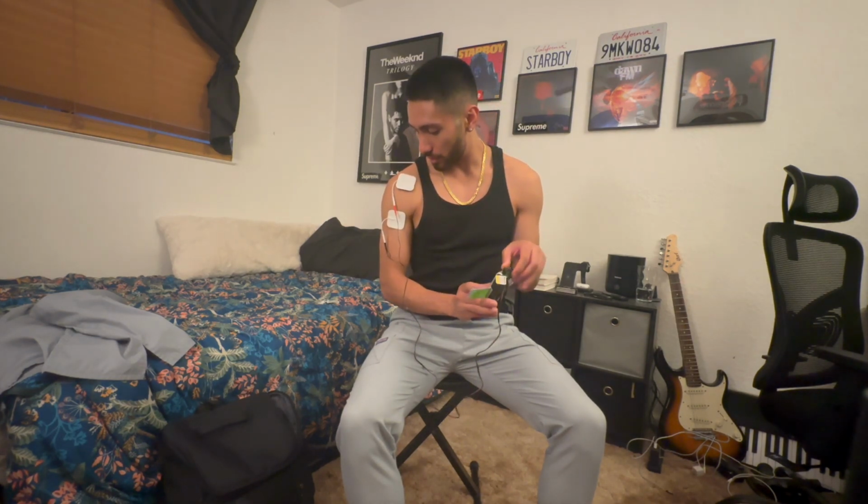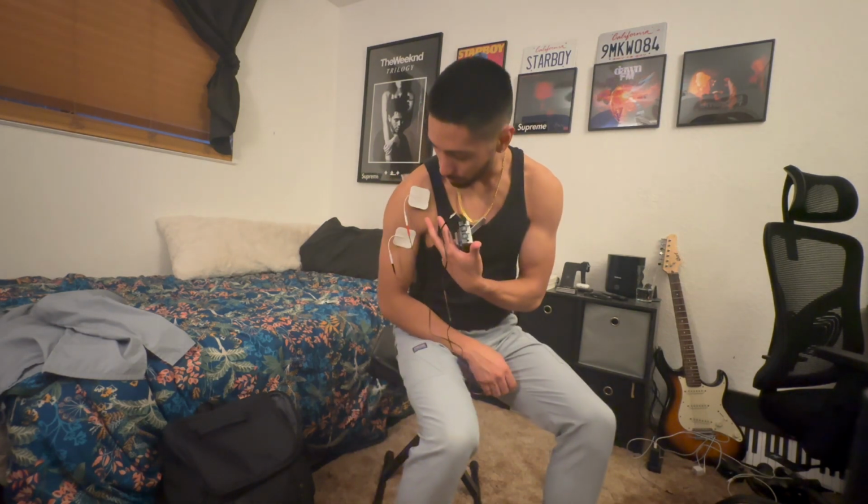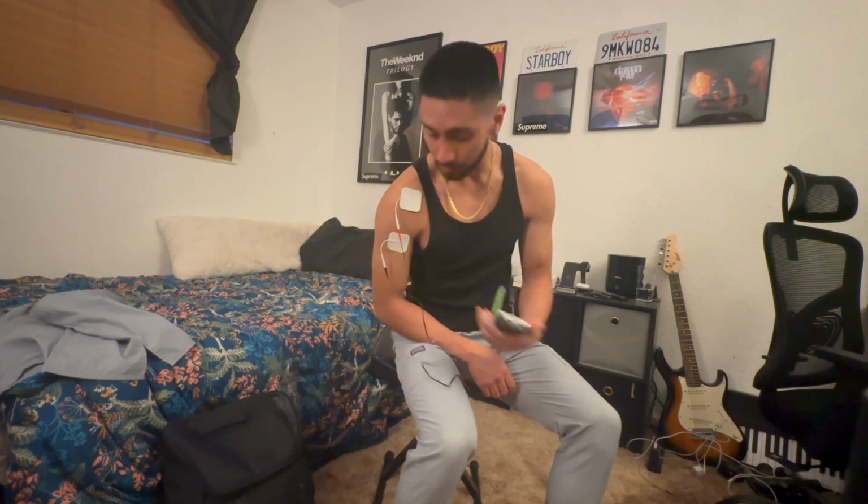We're just going to do a brief, and you guys will see that muscle twitch going on. I'm going to set that at 20, and then I'll adjust that intensity knob until I'm feeling this motor twitch sensation going on. Right in there, right away, we're at intensity 4, and we're seeing the fibers twitch up. I think I could turn that up more, because it's going to be at my comfort level. Right there, we can see motor twitch going on. Strong contractions, I'm feeling like it's an actual muscle pump going on. It's a tap, tap, tap, tap going on for our acupuncture setting.